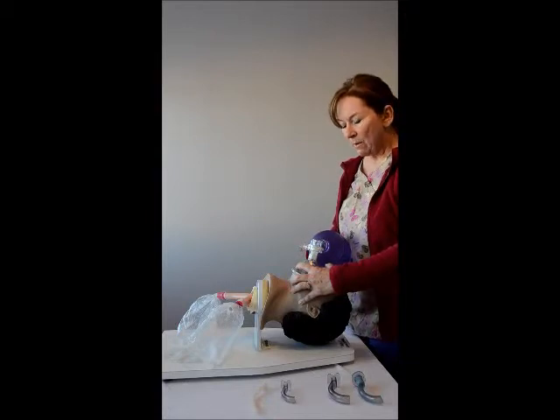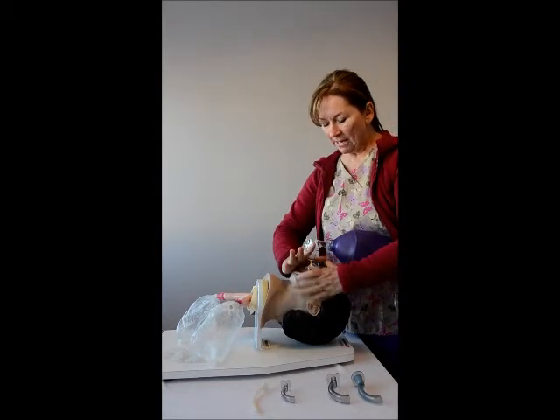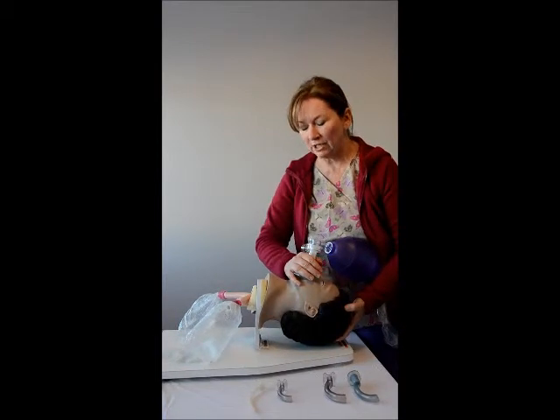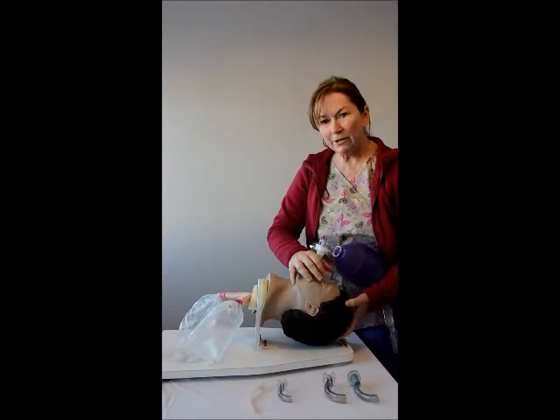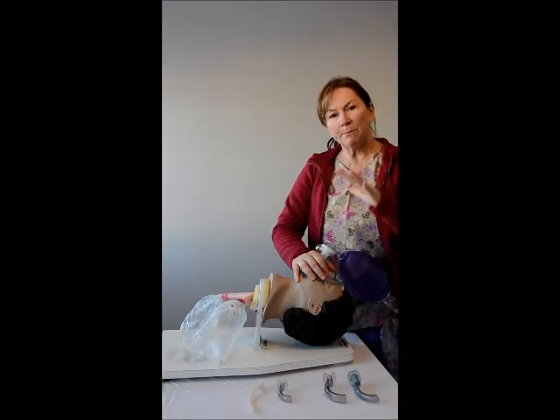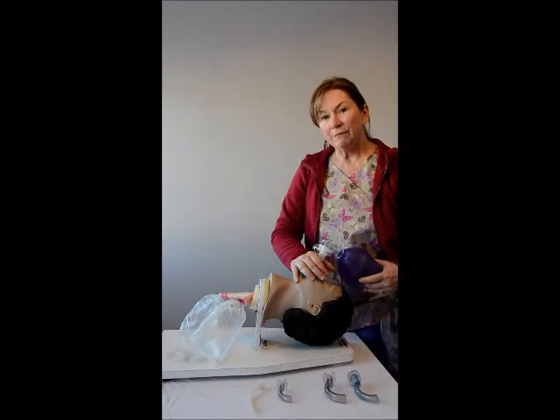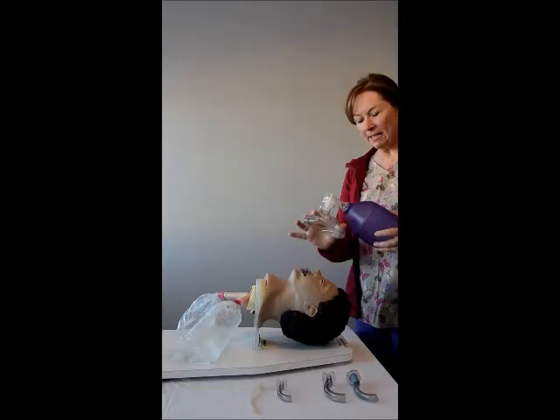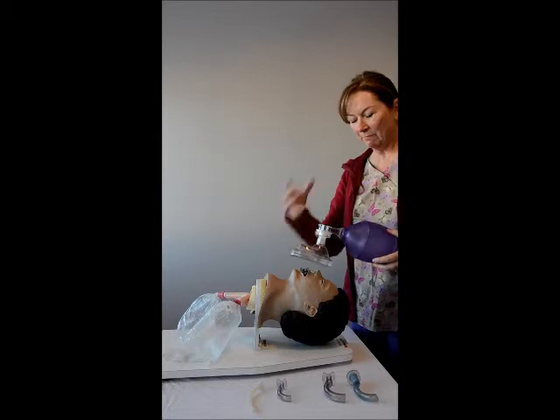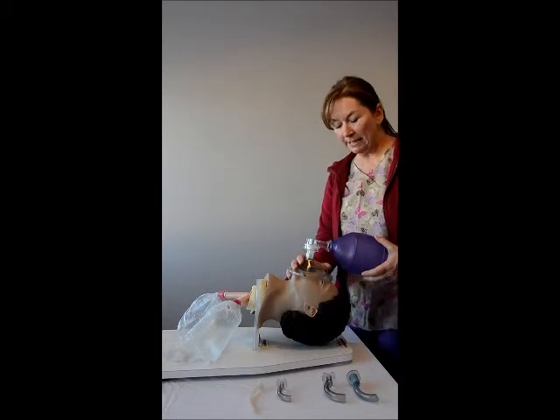Another technique — I'm not sure if it has a name — is to place your whole hand on the mask. Make sure you don't obstruct the airway; maintain the head tilt chin lift by keeping your little pinky under the jaw as a reminder. Your whole hand then puts pressure on the mask, which may help you obtain a better seal. This is an alternate technique if you have difficulty with the C technique. When placing the mask, remember the narrow tip goes toward the nose — improper positioning will impact your ability to provide airway management.